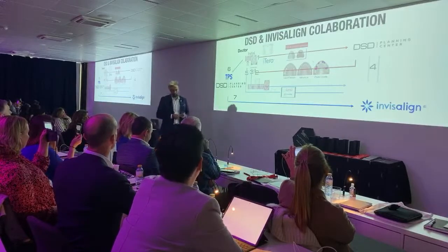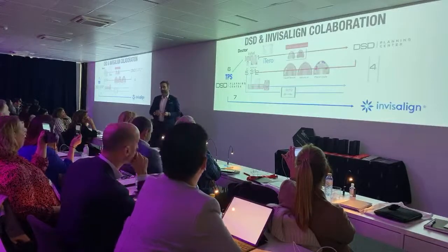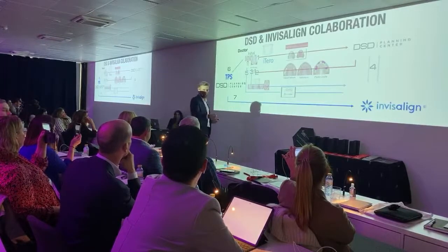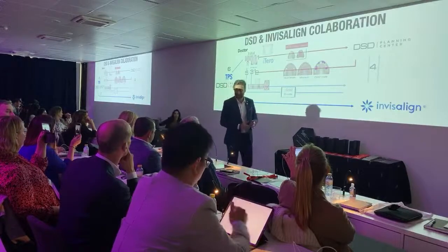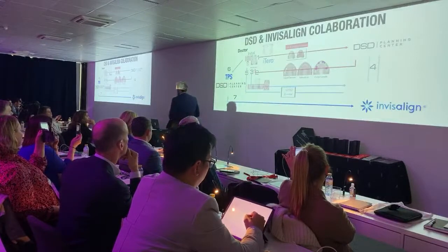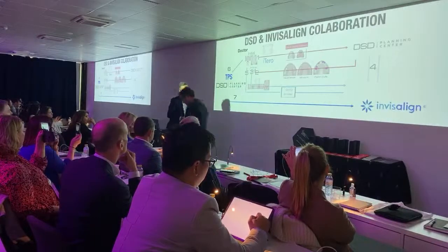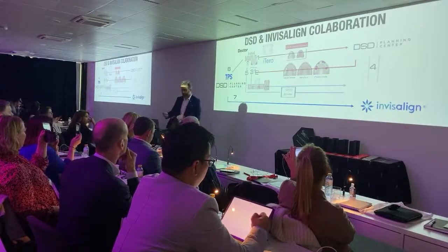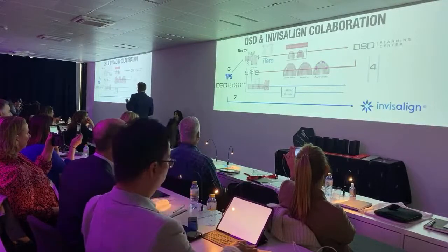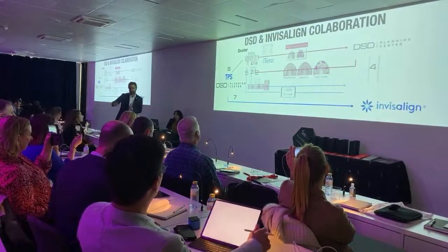And all of you that are already inside the collaboration received an email from us, not just explaining TPS, but also sending you a document. Of course, everything that we do in Invisalign needs to be signed. So you need to sign a document, and we also sent some videos to show you how to activate this option, because it needs to be activated inside your IDS. So there are certain easy steps that you need to do just one time, and we can help you with that also. But once you activate that, then it's an every-case decision.